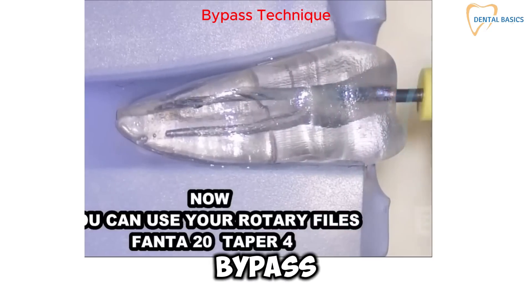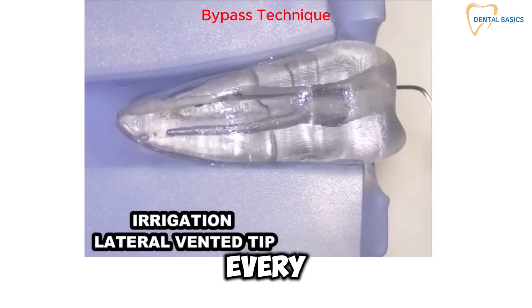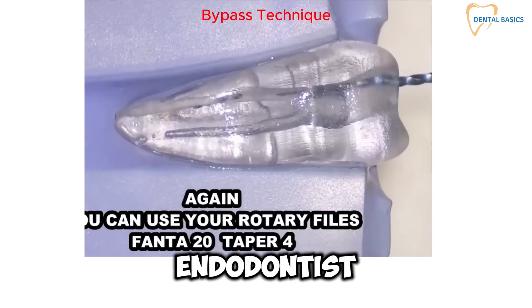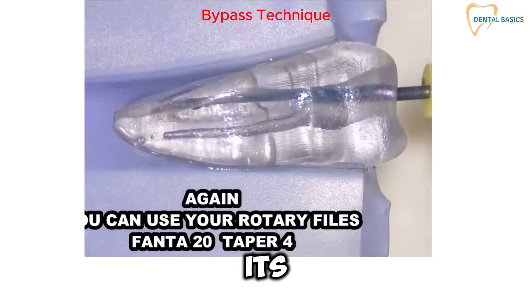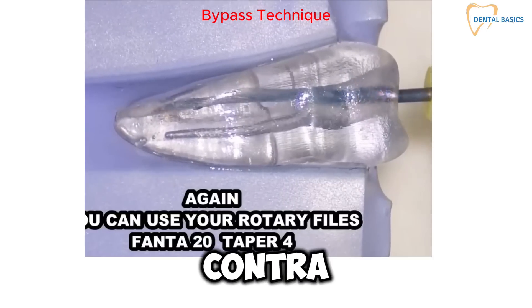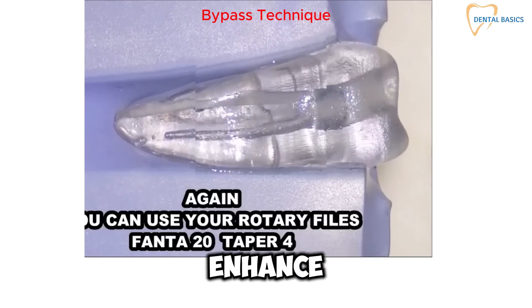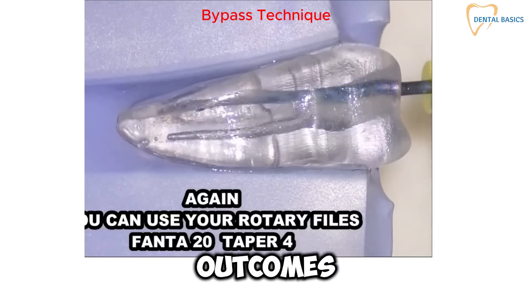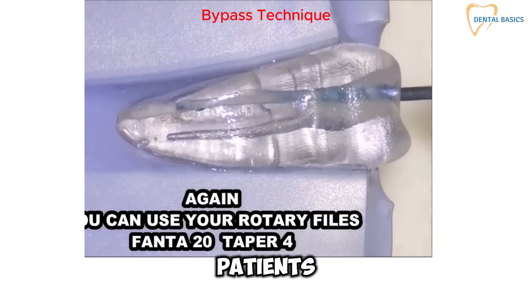Endodontic file bypass is a valuable skill for every endodontist. By understanding the procedure, its indications and contraindications, you can enhance your clinical outcomes and provide optimal care for your patients.